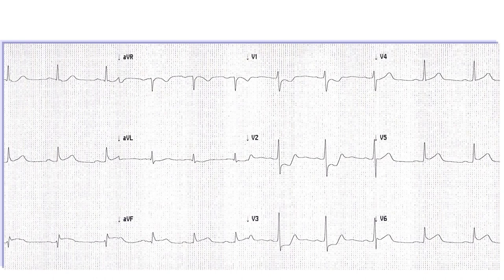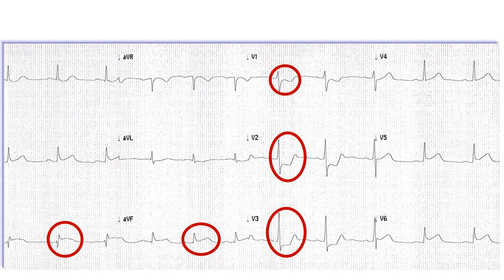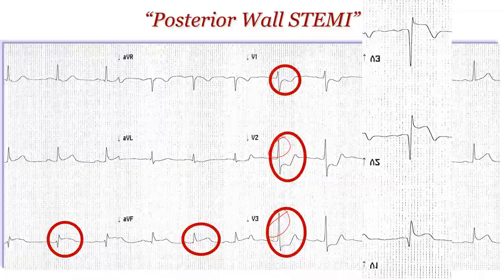In another example, we see ST elevation in leads 3 and AVF — an element of inferior wall STEMI. But if you look carefully, there is also ST depression in V1 to V3, with an upright T wave and quite tall R waves in V2 and V3. I would expect shorter R waves there. This appearance means that if you look at the heart from the back, flipping this ECG upside down, it would suggest you should suspect posterior wall STEMI.